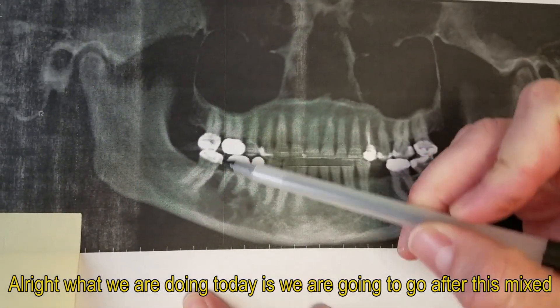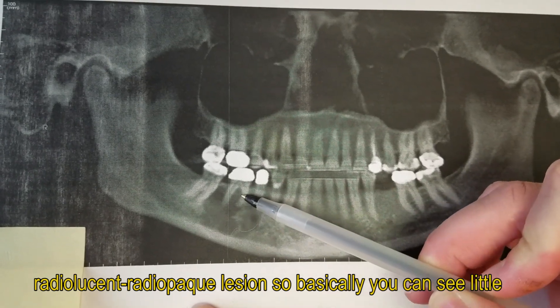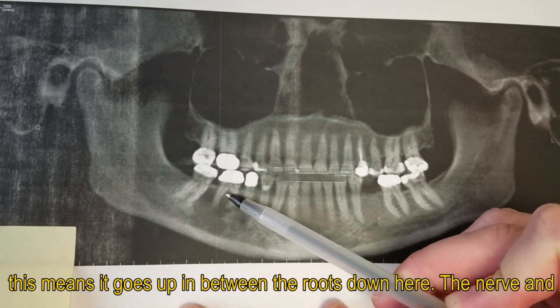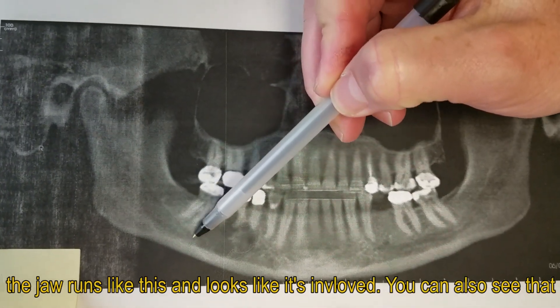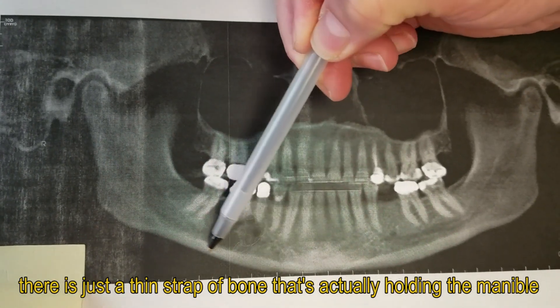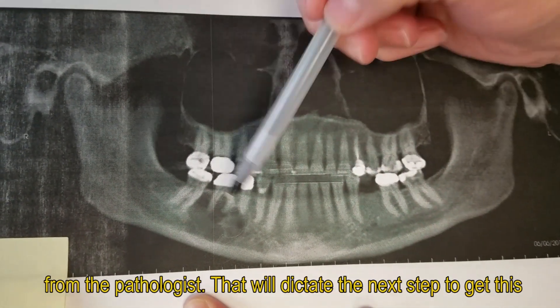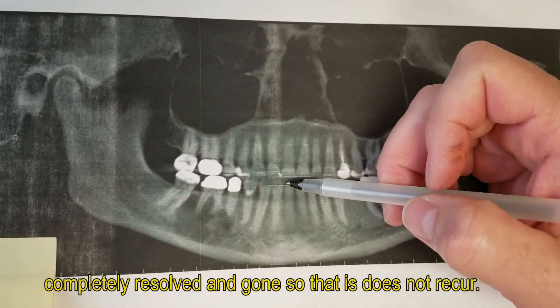What we're doing today is going after this mixed radiolucency radiopaque lesion. You can see little flecks of calcium and calcifications within it — it's multilocular. It goes up in between the roots, and the nerve in the jaw runs through this area and looks like it's involved. There's just a thin strap of bone holding the mandible together here. We're going to take a little wedge — a specimen — and send it off to find out what it is from the pathologist, which will dictate the next step to get this completely resolved.